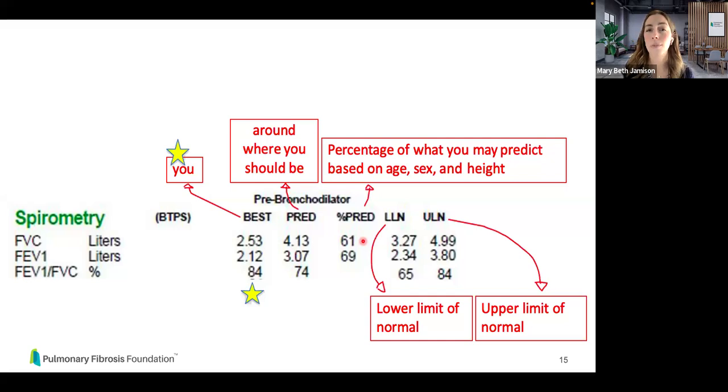That's why maybe wearing something comfortable and knowing what you're getting into helps. It's not uncommon for people to do better their second time because they know what to expect. And that's why we do so many over time, because maybe you just weren't comfortable in the booth that day and didn't do as well as you thought you could. So we're always looking at everything over time.